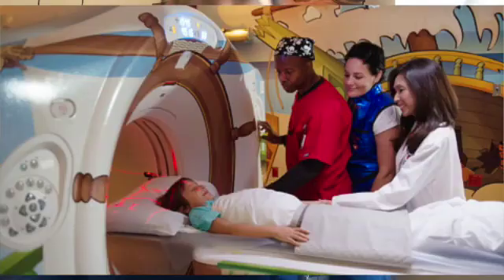If the provider has ordered the sedation, then you will have to have someone with you, and that is something to notify the client, that they cannot go to this test without anyone else to drive them back home. And for pediatric clients who will be undergoing MRIs, you want to show them a pretty fun educational video that involves MRIs so they have a better understanding of it. Let the child know, just the same as the client, that hey, you're going to be hearing some kind of noises, but that's okay, that's to be expected, so the child can calm down.